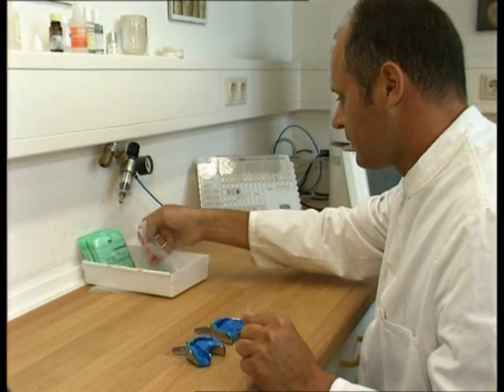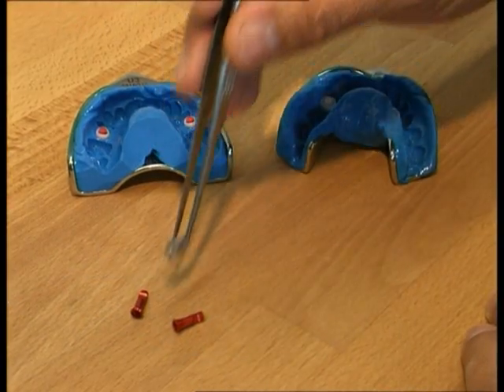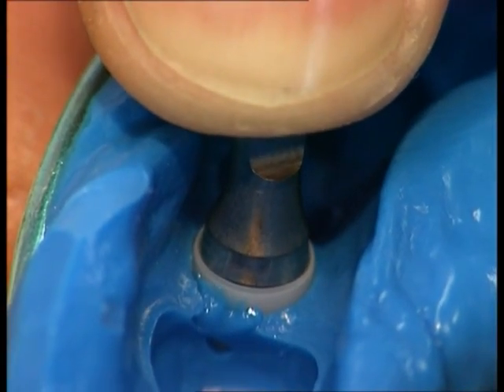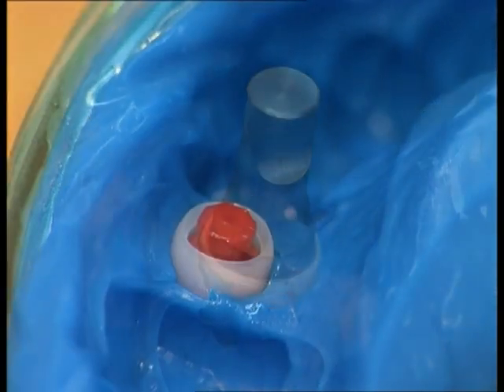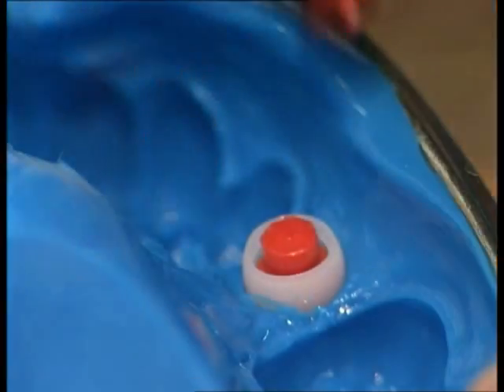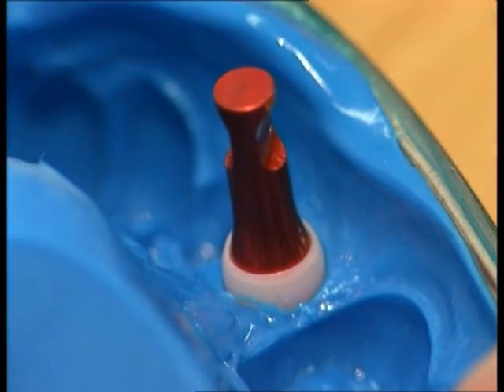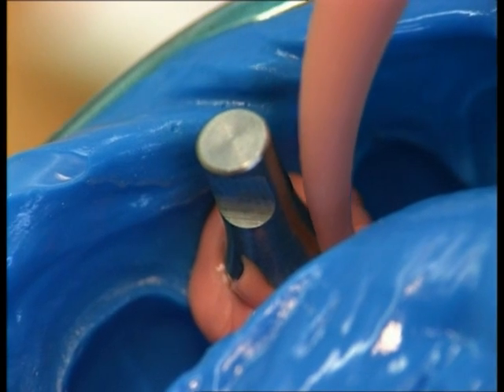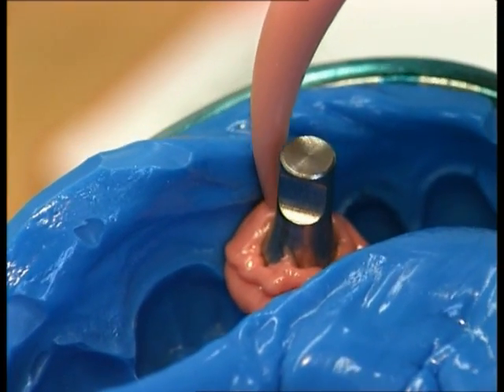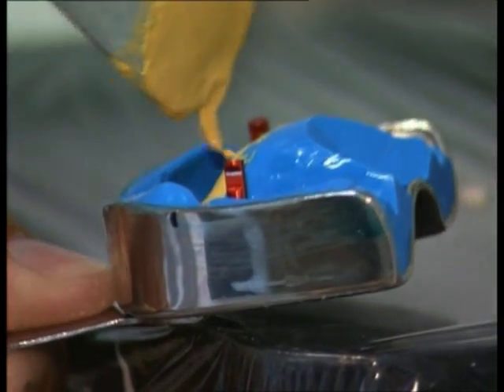The corresponding analogues are selected in the dental laboratory. When repositioning the analogues, care must be taken to ensure that their shoulders snap firmly into place. A gingival mask should always be used to achieve an optimal cervical crown contour. The working model is created, as usual, using dental stone.